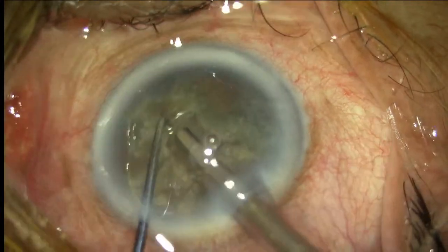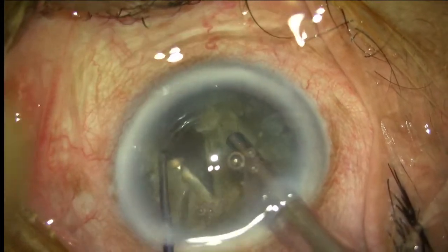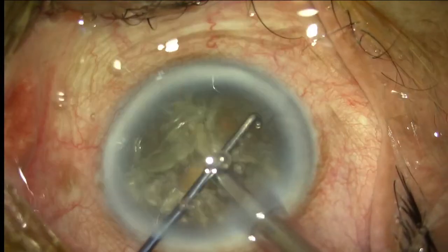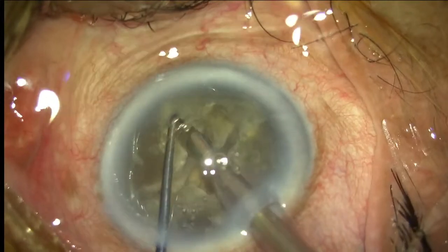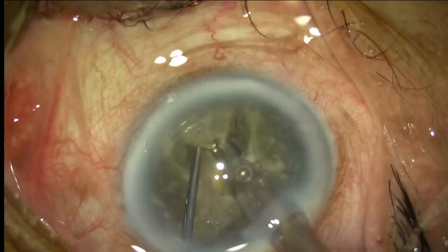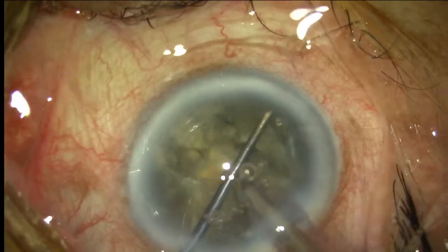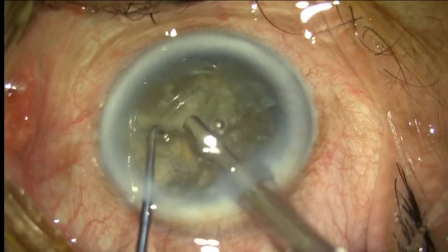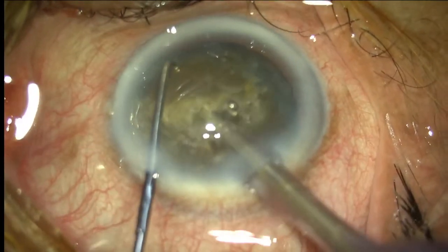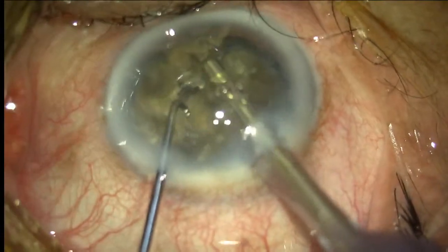So see the nucleus actually, because the posterior plate is what you get the trouble. But here you can see the posterior plate is broken, but I'll have to do a complete separation. So from this side, I've completely separated. The first complete separation of the nucleus is very important. So if you get a complete full thickness separation from the center, I'll just try to bring out one segment and do a sub chopping. So I have this piece now free.